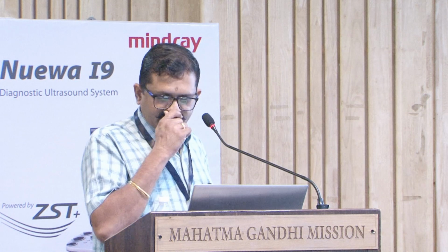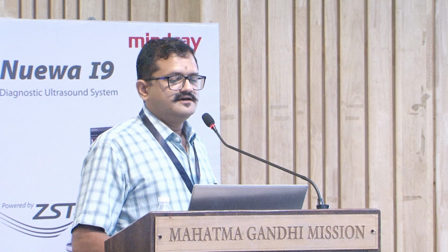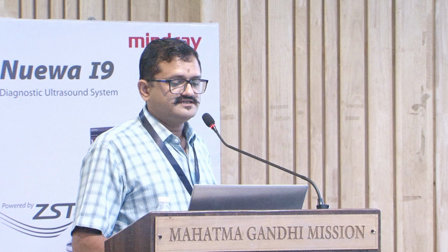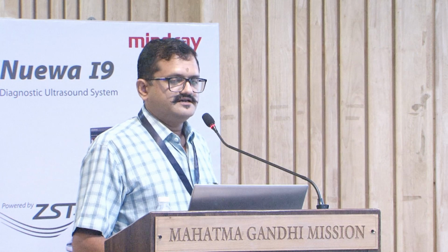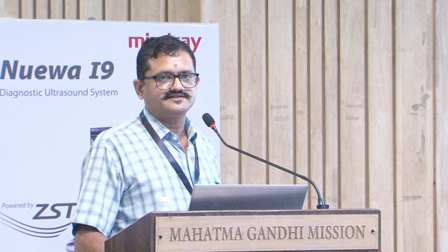In the non-vascular part, we can do HIFU, laser or thermal ablations of prostatic nodules or lesions, then PCN catheterizations in obstructive uropathy or pyonephrosis, abscess drainages, drain placements in the perinephric areas, then post-renal injury perinephric hematoma, as Shana madam told us, the large hematomas displacing the kidneys and all, we can manage them with only ultrasound guidance.